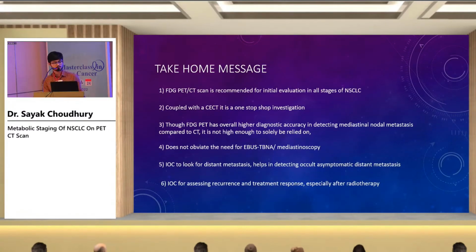So the take-home message is that FDG PET scan is recommended for initial evaluation in all stages of NSCLC. Coupled with CT, it is a one-stop shop investigation. Though FDG PET has overall higher diagnostic accuracy in detecting mediastinal nodal metastasis compared to CT, it is not high enough to solely rely on it, and it does not obviate the need for EBUS, TBNA, or mediastinoscopy.